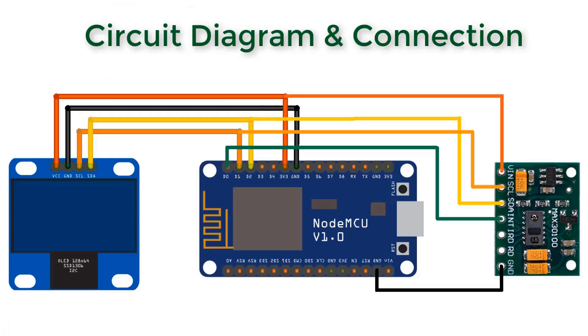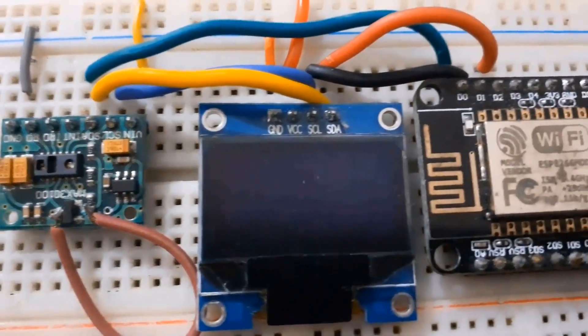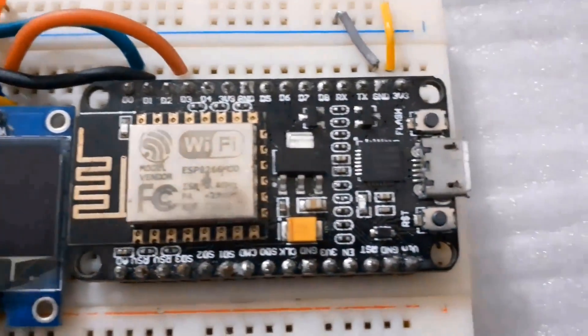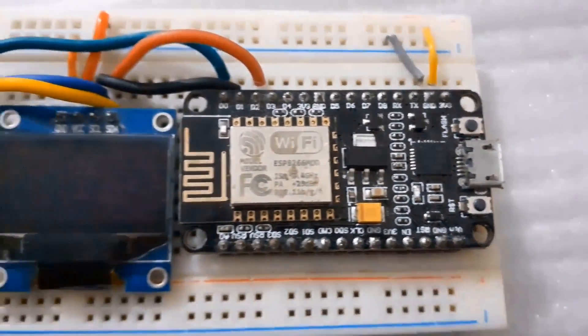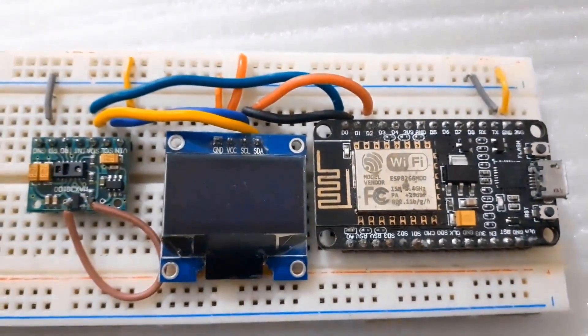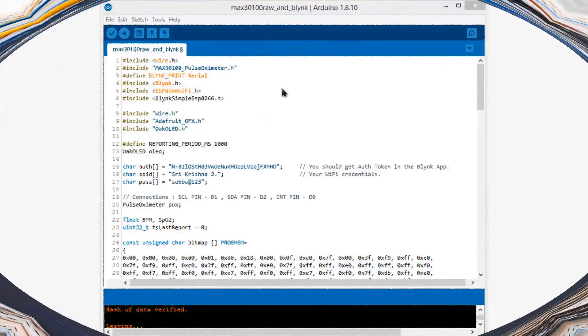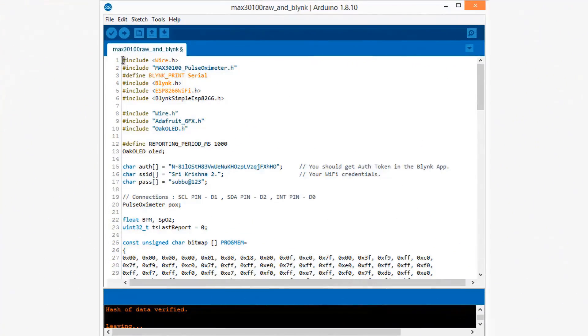Connect the interrupt pin of the pulse oximeter sensor to the D0 pin of NodeMCU. Supply 3.3 volts for the OLED and MAX30100 through the 3.3V pin of NodeMCU. Here is the assembly — I assembled the circuit on a breadboard. You can see the OLED display, the pulse oximeter sensor, and the NodeMCU board. The connections are fairly simple.